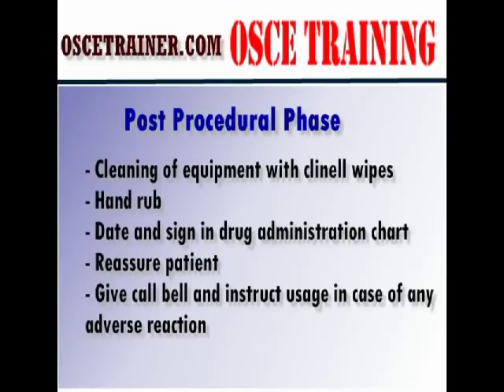Clean the inhaler after putting on gloves with cleaner wipes. Keep it aside to dry. Do a hand rub, date and sign the drug administration record. Come back to the patient. Health educate the patient about the usage of the metered dose inhaler if required. Reassure the person that you will be around for 30 minutes and, in case of any adverse reactions, to press the call bell so that you can come back. Open the curtains or blinds, do a hand rub using the 7 steps of hand hygiene and leave the room.